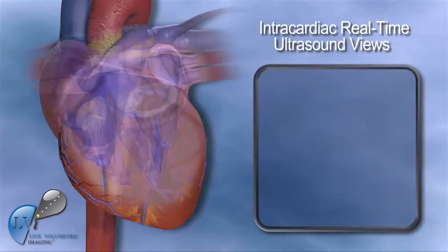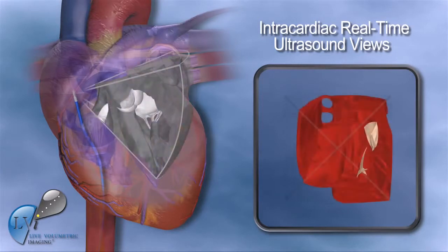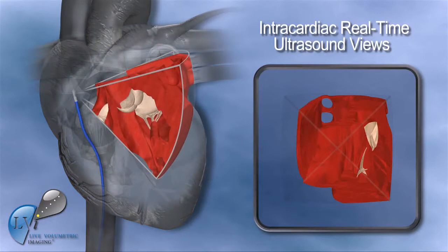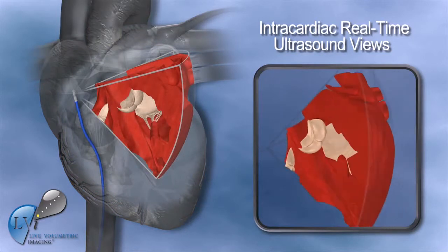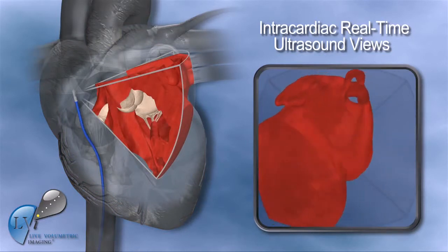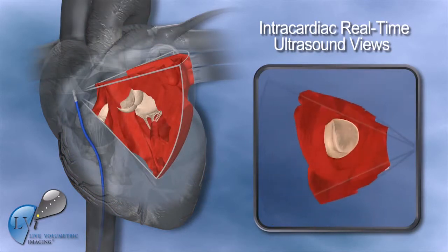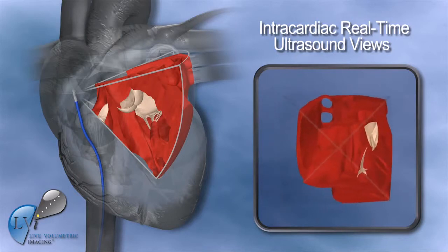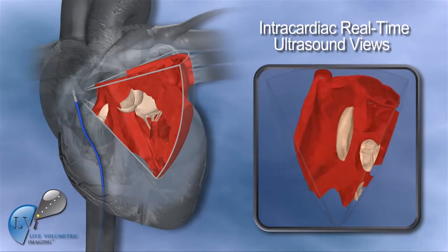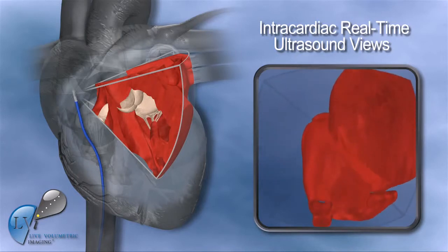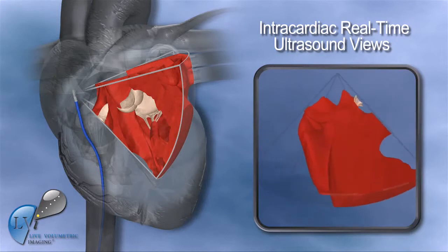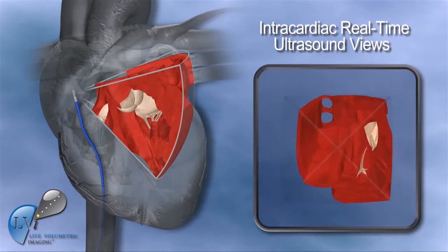The LVI catheter is inserted through the femoral vein and inferior vena cava into the right atrium, and provides a volumetric view into the left atrium and ventricle. This volumetric view of the beating heart can be rotated using a 3D ultrasound imaging system to display any arbitrary orientation within or around the volume, without any repositioning of the imaging catheter.